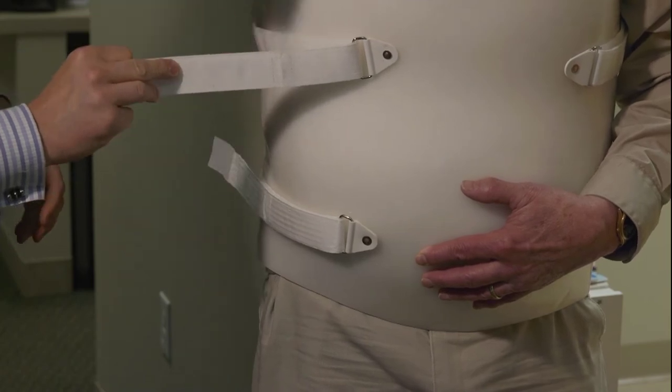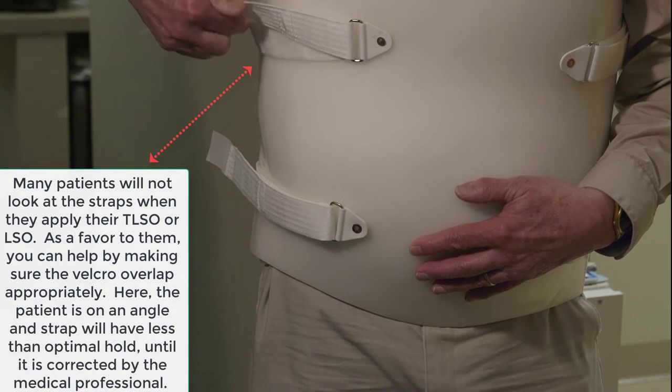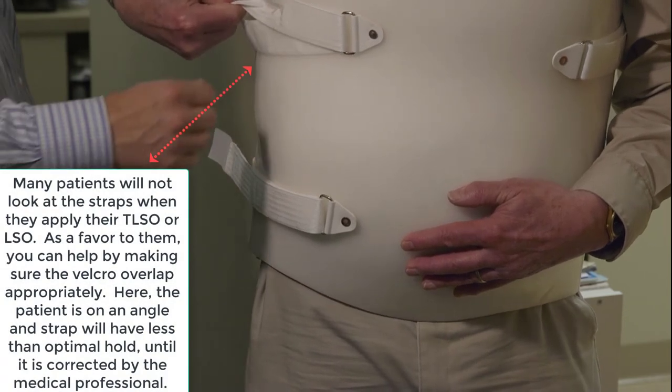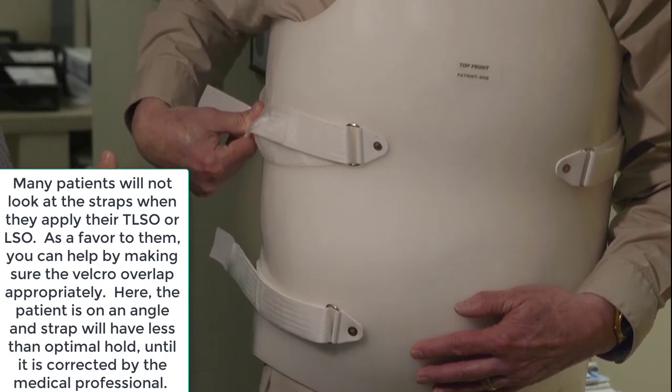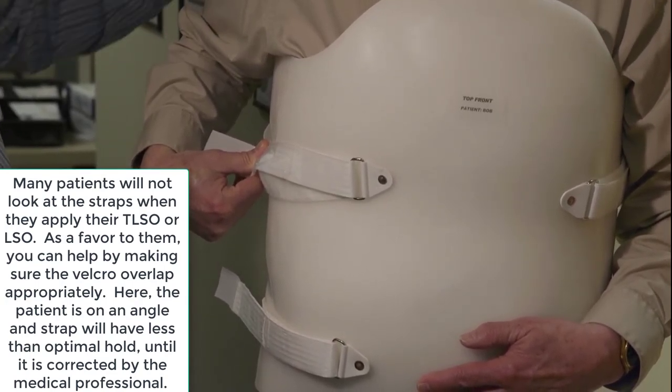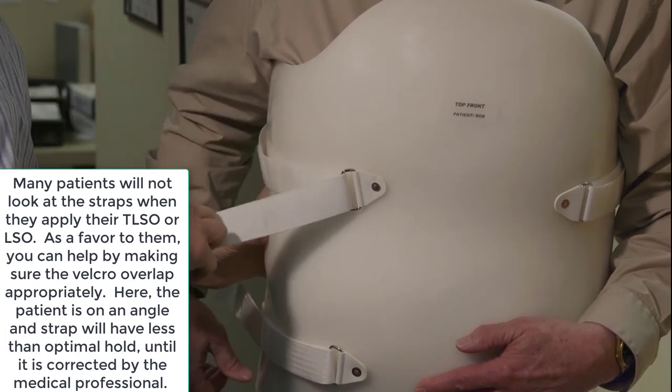Bob, I'm going to have you do this one. We're going to show everyone how you can pull back on this a little bit better. He just pulled back on the strap, and you can see he would have never been able to do that against a wall because he would have bottomed out.